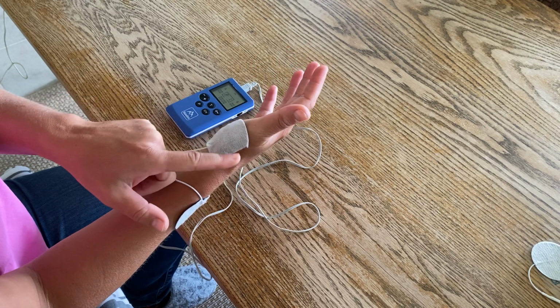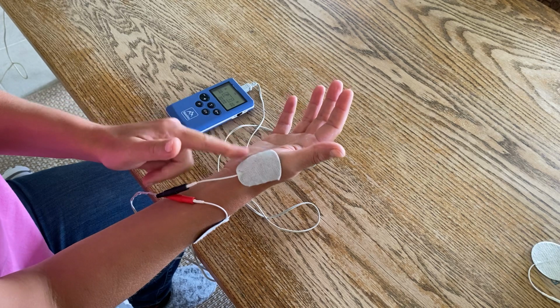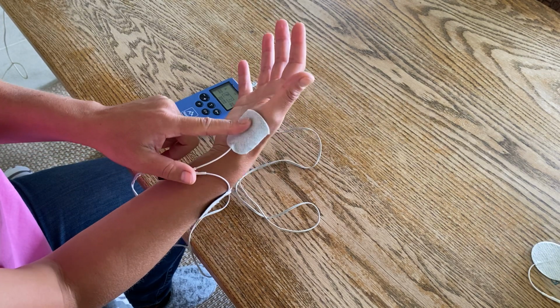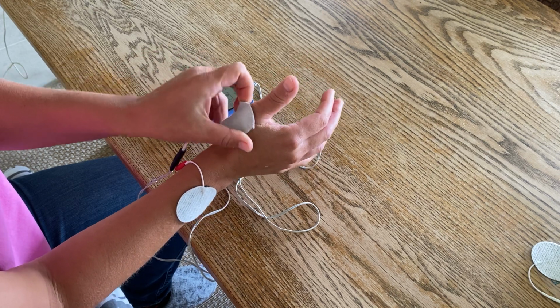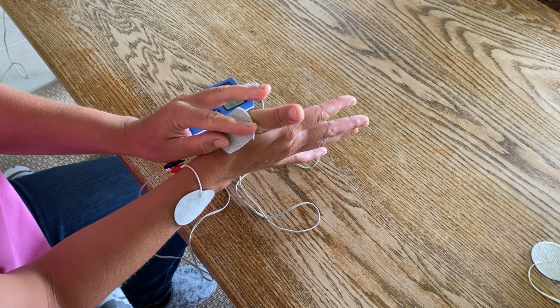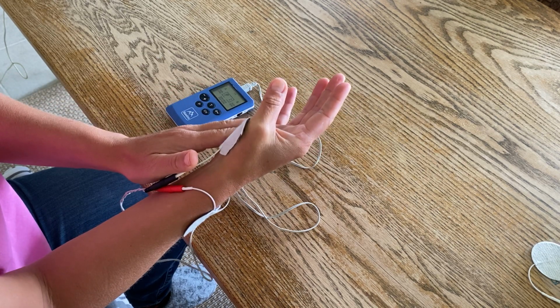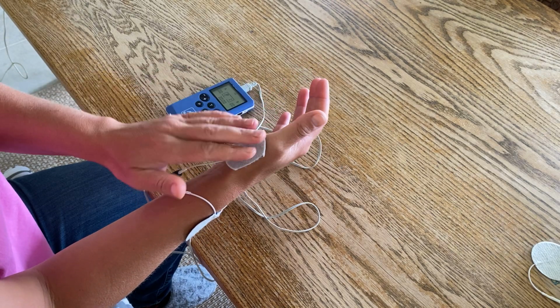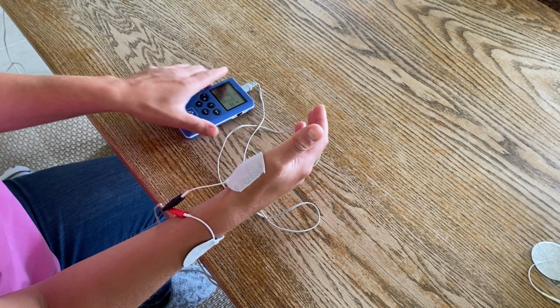So that's why I've trimmed it just with a pair of normal scissors, obviously not cutting the wire, so I'm cutting down the edges. And then you may need to play around with placement of this. If I have it too far round that direction, I'm likely to get my thumb going over there. Too far underneath, I'm likely to get my thumb pulling down. So that can take a bit of practice. Just make sure the edges are stuck down well.